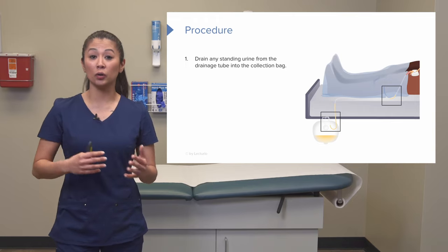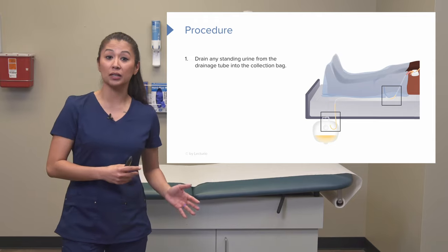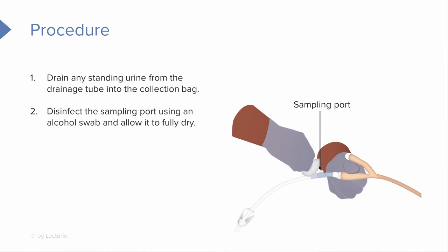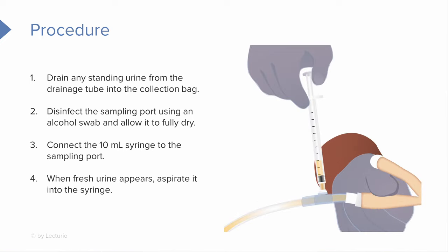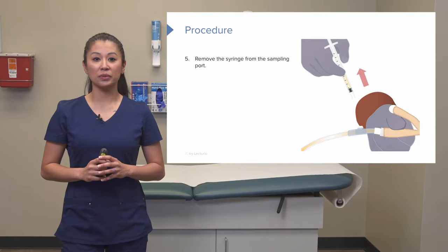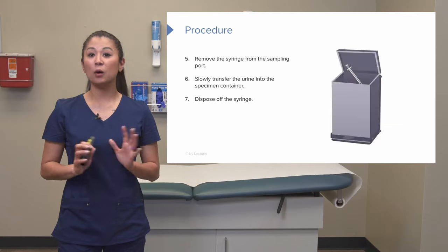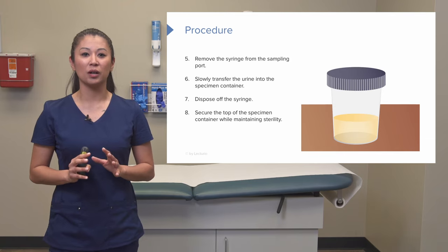If there's some extra urine in the drainage tubing, we want to drain any standing urine from the drainage tube down into the collection bag. Once we've done this, we can take those alcohol pads and disinfect that port using an alcohol swab, then allow it to fully dry. Now we can connect our 10 ml syringe to the port and pull back on the plunger. When we see fresh urine, we can aspirate the urine using that syringe. Remove the syringe from the sampling port and slowly transfer the urine into the specimen container. Dispose of the syringe and secure the top of the specimen container while maintaining sterility.